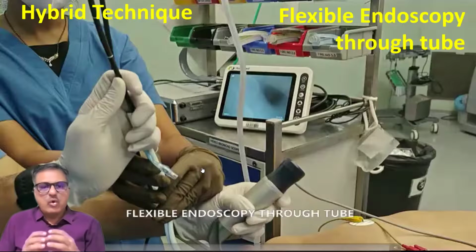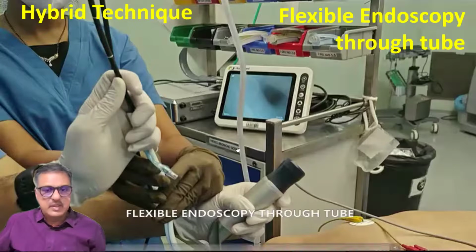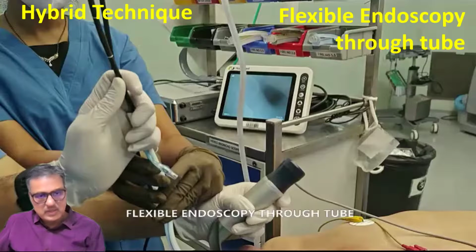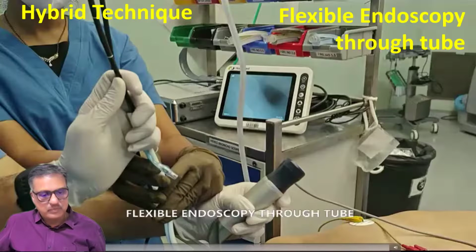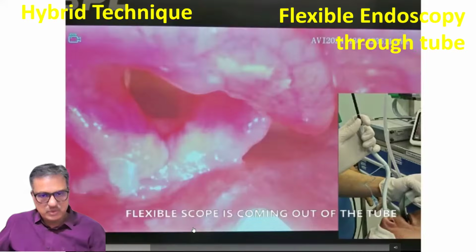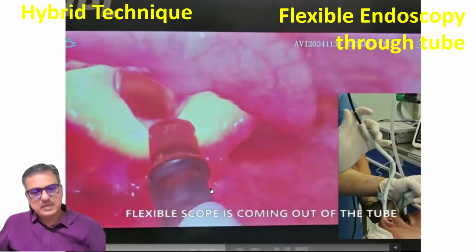In spite of doing all the maneuvers, if you are not able to negotiate the endotracheal tube into the larynx, then you have to deploy a hybrid technique. What you have to do? Through the endotracheal tube which is passed from the nose up to the pharynx, pass the flexible endoscope through the tube, keeping the videolaryngoscope in situ, then negotiate the scope inside the larynx.